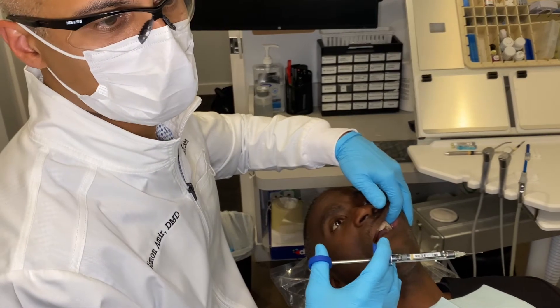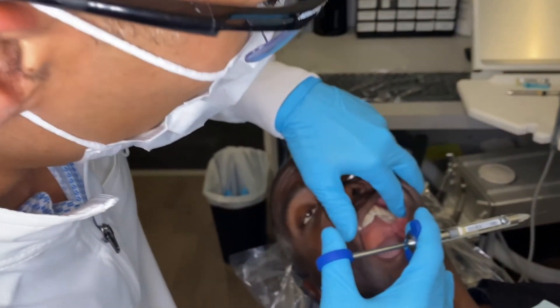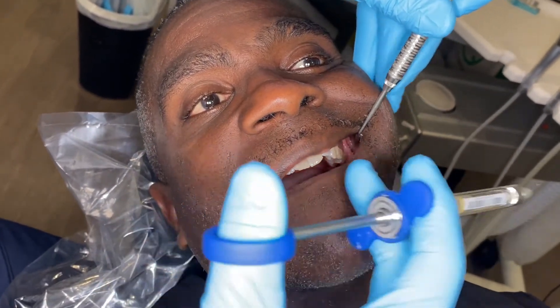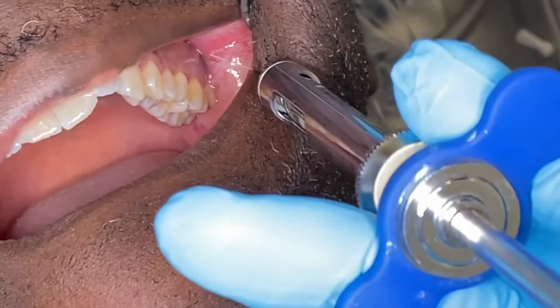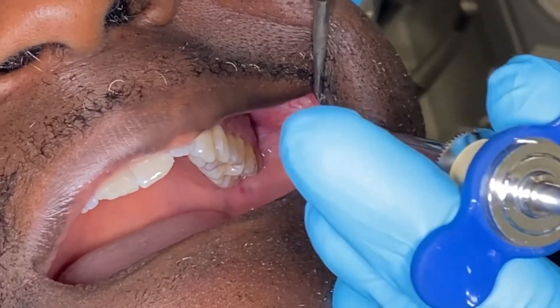You need to go further back towards the brain, basically. I'm going to use a mirror here — you probably have retractors you can use. Using a finger is not a great idea here. We're trying to reach around the back of the maxillary tuberosity, which is the bump on the gums or bone right behind their last molar. I'm going to have the patient close down halfway until the lower jaw drops back, and I'm going in 45 degrees in three dimensions — up, back, and inward — around the back of that. Usually half a cartridge of lidocaine is sufficient.